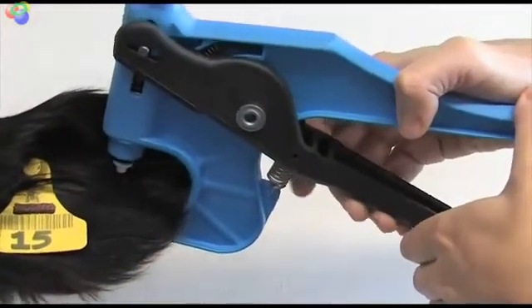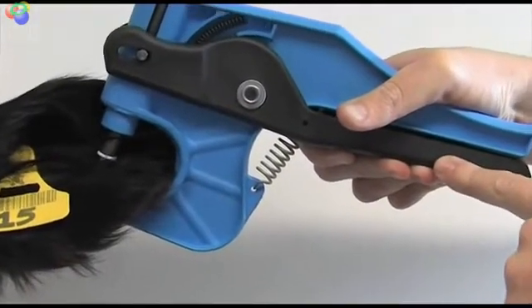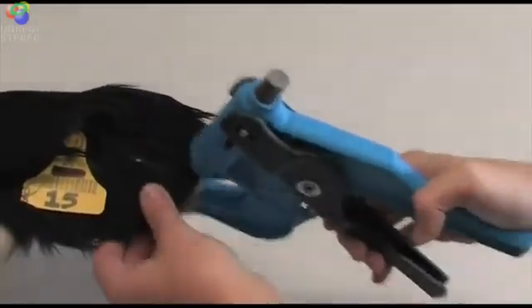Depress the gun's handles down until they are fully closed. There's no need to put any extra pressure on at this point — a sample has been taken. Release the gun and it releases the ear. Try to keep the sampling smooth and quick.